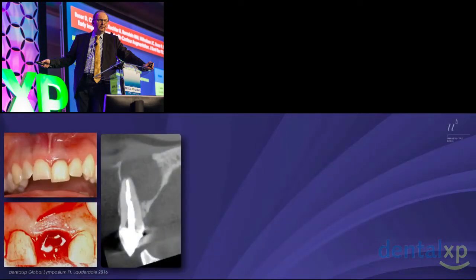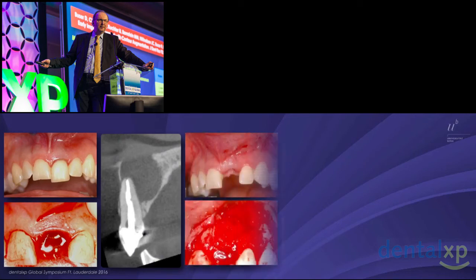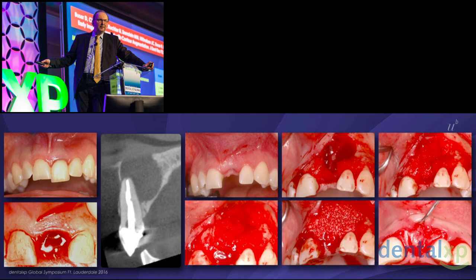I show you two patients. You see, this is a cystic lesion. I treated about 6 years ago now, and you see, we pulled the tooth. The patient was symptomatic. Then the symptoms disappeared. The pressure disappeared through the socket. And then I opened up and took the cyst off. And then we did here, you could say, a ridge preservation technique. It was not an augmentation.